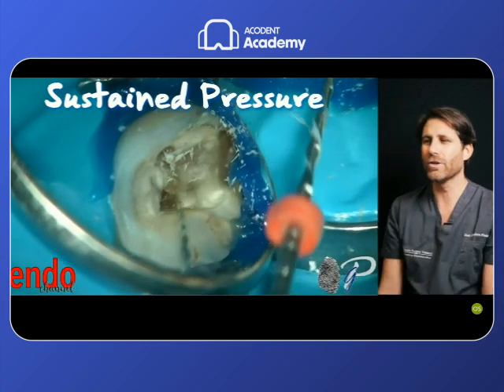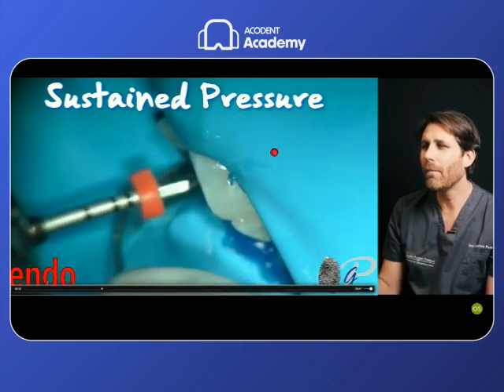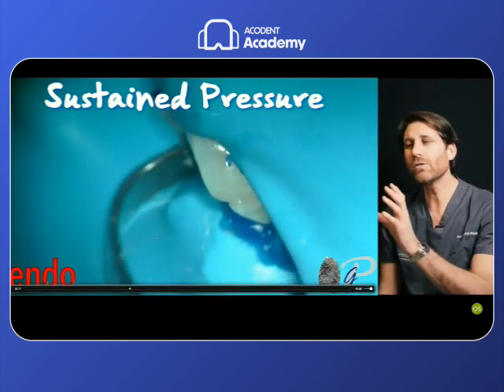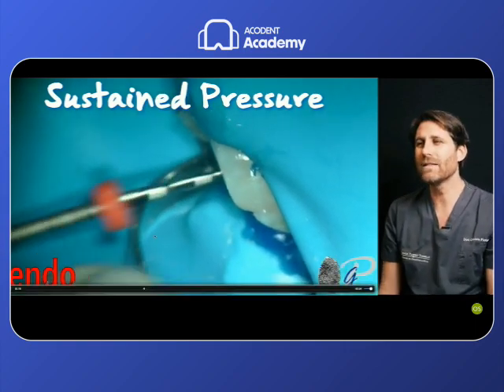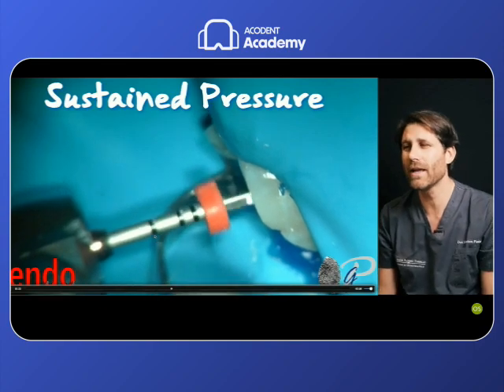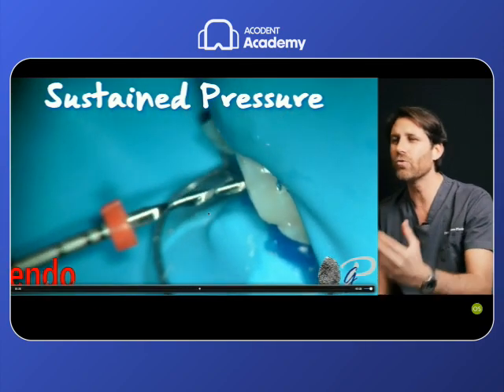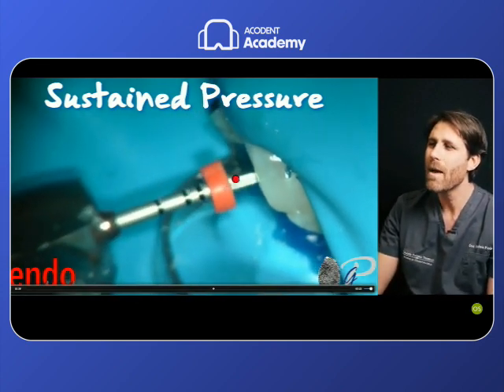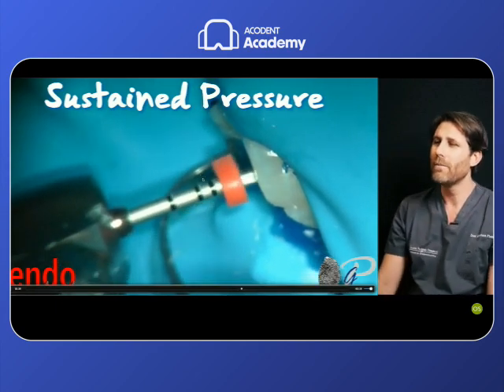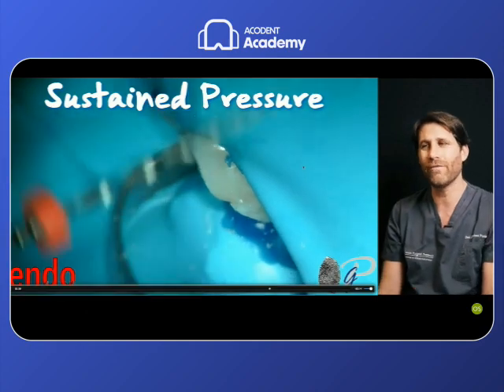This pushing action is just to try to put the file deeper in the canal. So push and go away. This is already too much time. Now we have established 1, maximum 2 seconds. Push and go away. No need to stay so long. But you can see we are penetrating 0.1, 0.2, 0.5 millimeter. Look at the rubber stop, pushing and penetrating a bit. Look inside the root canal, penetrating a bit inside the root canal. We are creating our glide path in the path of least resistance.